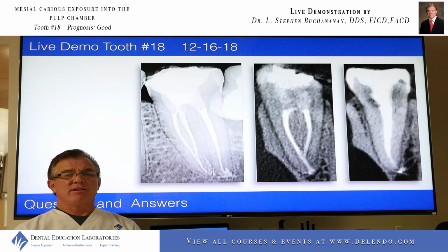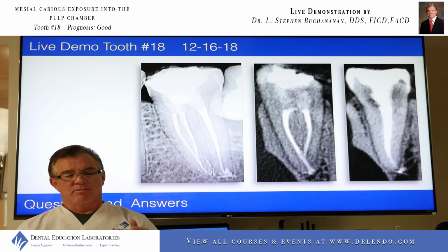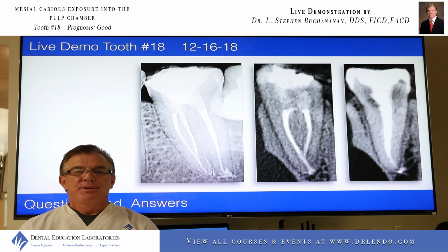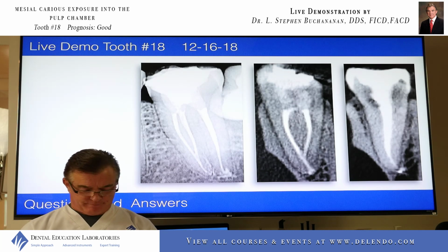And these are the files that are recreating the most natural look in the GentleWave cases that we're seeing, from Clammy, Steve Frost, all my close friends, Ryan Facer. We're all trying to get as small as possible, so we're trying all kinds of files. Sorry, I don't have a more definitive answer for you. If you want to understand how I've used GT files up until GentleWave, there's plenty of video on my website, endobuchanan.com or delendo.com. Check that out.